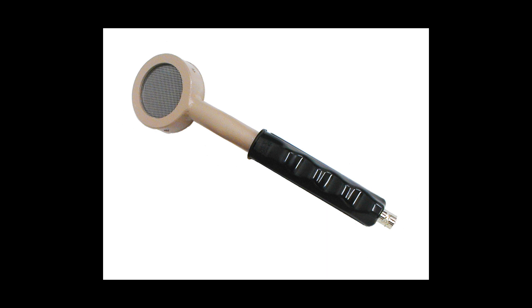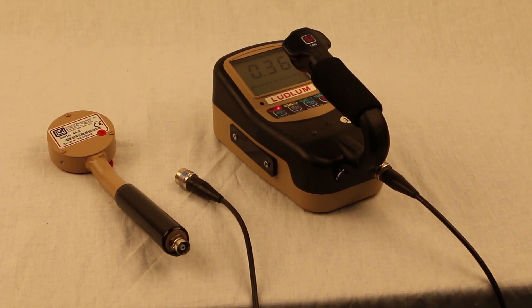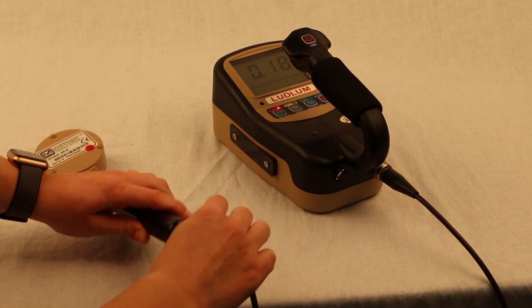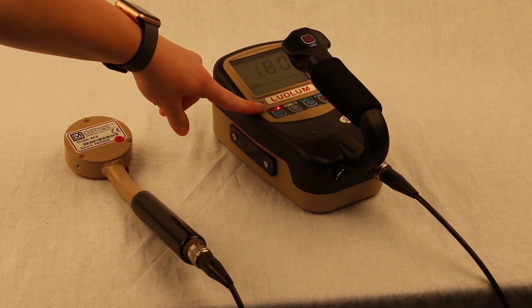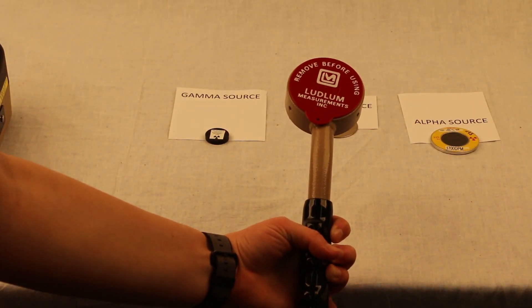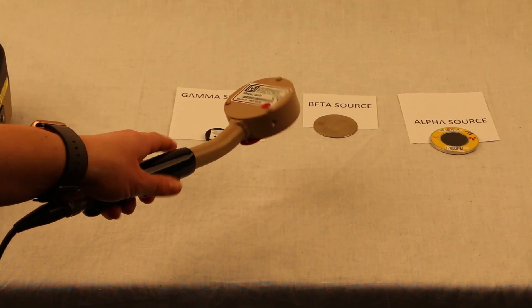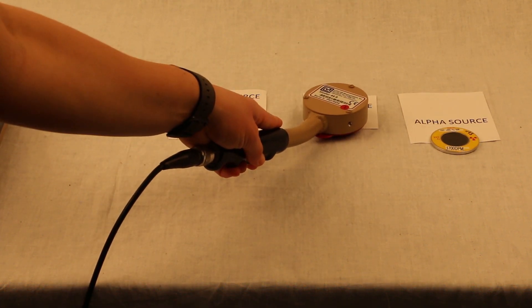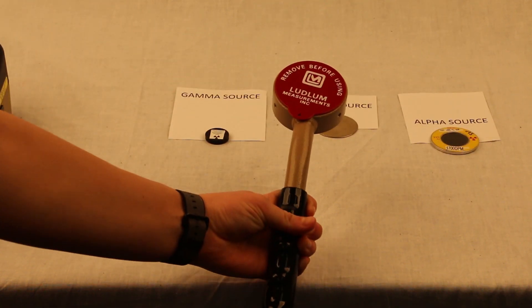The 44-9 can measure dose rate from 1 mR to 1 R per hour. If you need to measure higher than 1 R per hour, you need to switch to the Model 133-6 detector that's also in the kit. Connect detector number one, which is the Model 44-9, to the C cable. Ensure that the detector number one setting is illuminated on the Model 3001. The protective cap may be left on the detector when measuring gamma or x-ray radiation. However, the cap will block beta and alpha radiation, so the cap must be removed when measuring those.